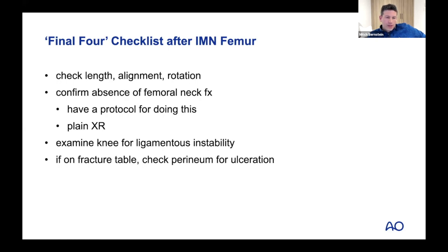If we're doing an antegrade nail, diaphyseal fracture, and the nail target looks funny in the distal segment, so if it's either too lateral or too medial, and like you said, it's riding along one of the cortices, then either I'll put a screw in that case to occupy the space, re-ream, re-nail, or just for education and to make sure I really understand, I'll take a flat plate.